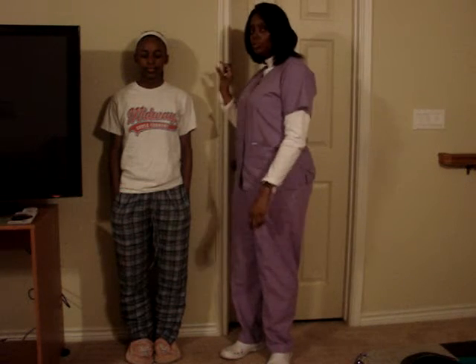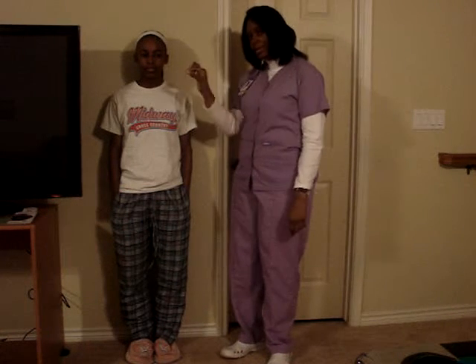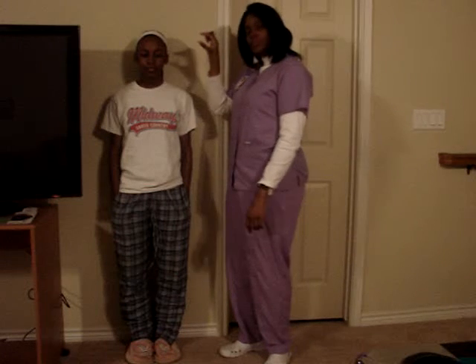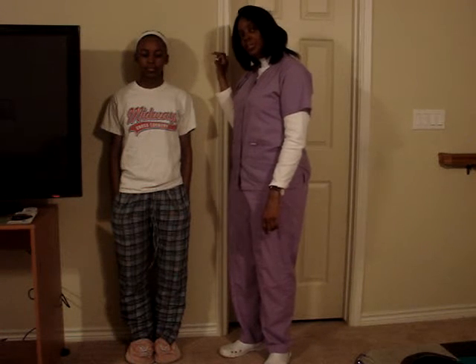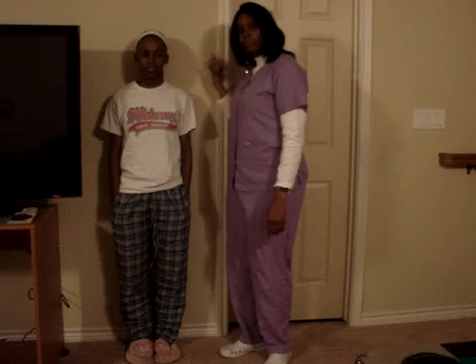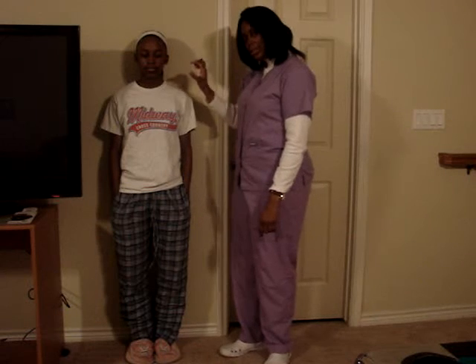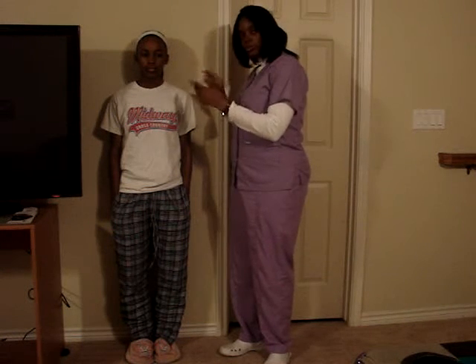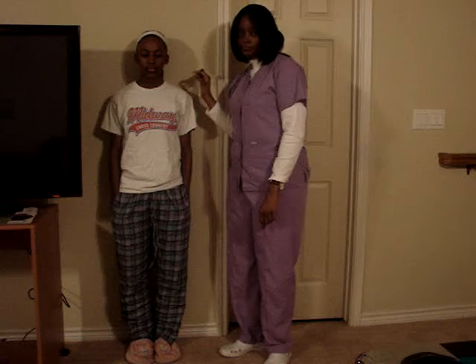On one of those kind of scales, to calibrate it, you push both of the levers all the way down to the end so that it's on 0. Then I would have Hillary take her shoes off and step up on the scales. I would move the first level adjustment, and I believe it goes up to like 100. For her, that would be plenty, as she weighs about 98 pounds. But for someone that weighs over 100 pounds, we would move the second adjustment level, and wherever the weight falls right in the middle, that would be their weight.